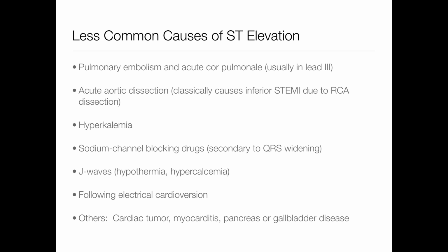You can also see ST elevation after electrocardioversion or defibrillation. So if we just did CPR, we defibrillated the patient, pull out the 12 lead, it's very possible you'll see some ST elevation just from us having done the defibrillation. Other things would be cardiac tumor, myocarditis, pancreatitis, and gallbladder disease. So yeah, pancreatitis and gallbladder disease. So lots of different causes for ST elevation.